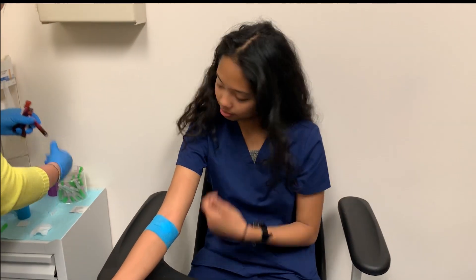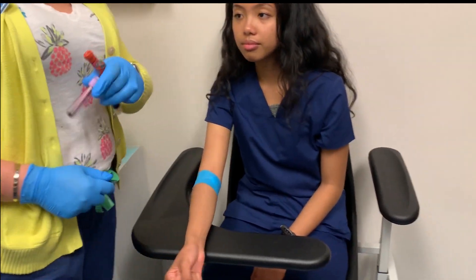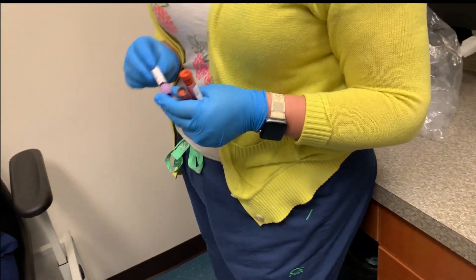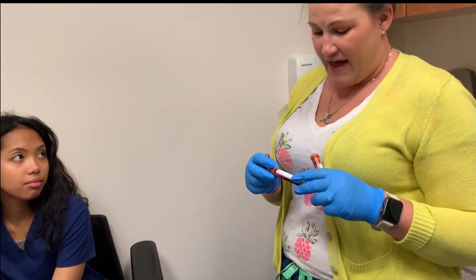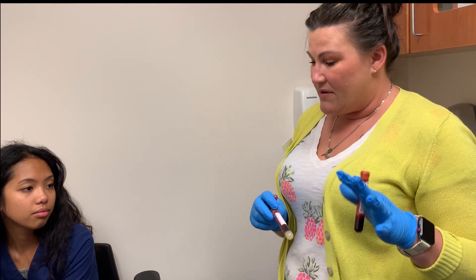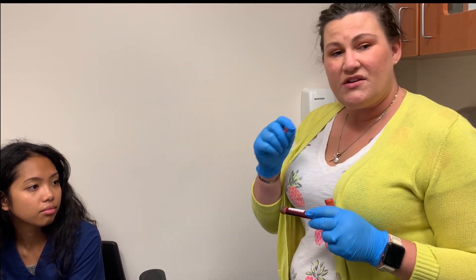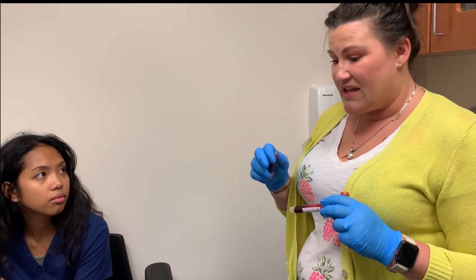When you're done, make sure that you label all of your tubes right in front of the patient. Label them with the patient's name and date of birth, the date and time of collection, your initials, and the ordering physician. Most of these tubes will have labels pre-printed because most lab systems now work off of electronic health records, which makes it really easy — you just need to initial and write date and time. Otherwise, make sure your lab tubes are always labeled before the patient leaves so they can verify that was their blood with the correct patient information.